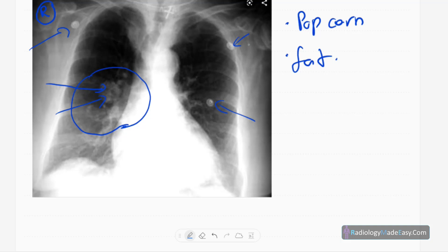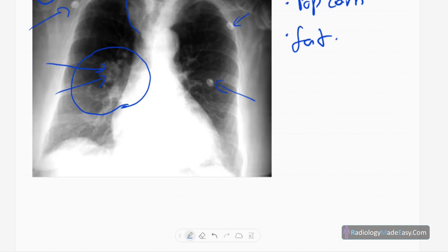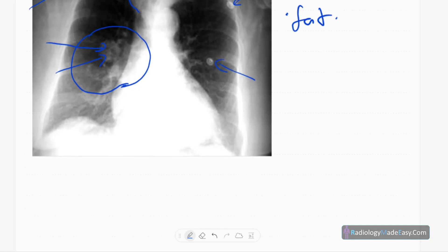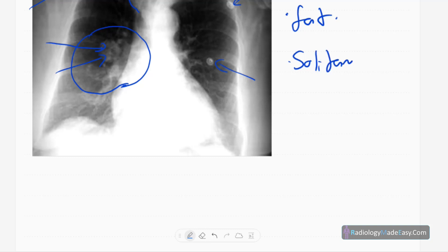There is no significant cardiomegaly in this patient, no synchronous lesions elsewhere, no bilateral pleural effusion or pneumothorax, no mediastinal masses — this is the SVC shadow — and no bony abnormalities. Overall, this is characterized as a solitary pulmonary nodule.